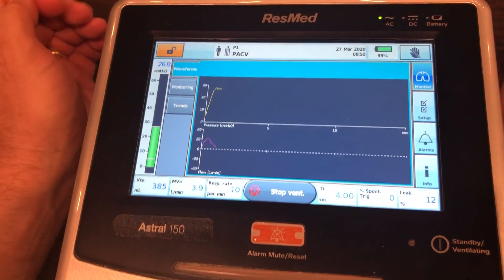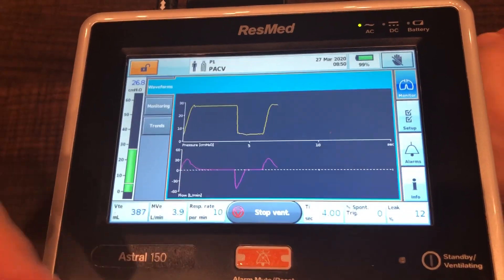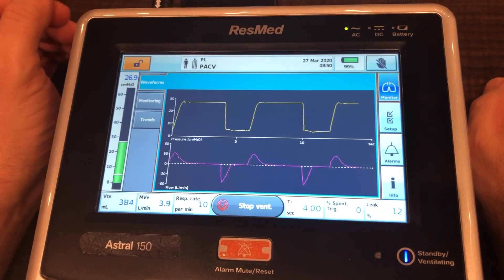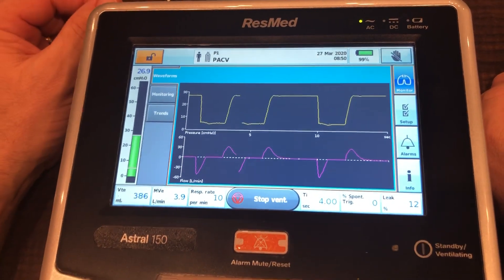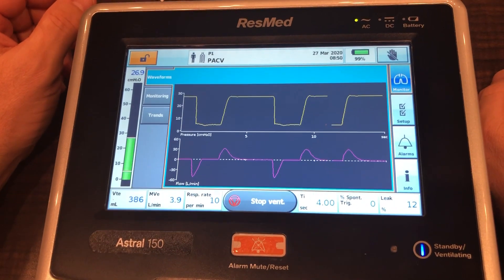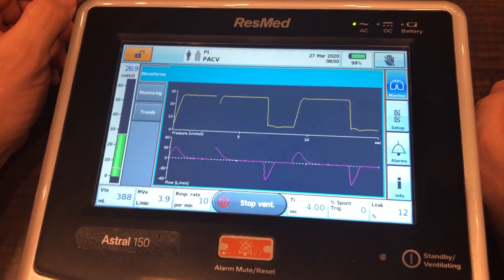We're still in our setup screen. If I push this button right here with the little set of lungs — that's the monitor — we can get a better idea and watch the pressure waveforms. We still get our readout on the bottom, so we can see our actual tidal volume. Minute volume is only at 4 right now but again this is just for the demonstration. Rate is 10 and I-time is set at 4 seconds. This is the Astral 150 by ResMed and we have achieved inverse ratio ventilation.